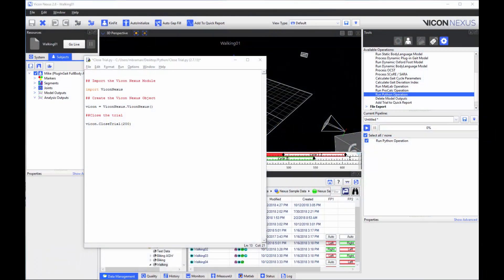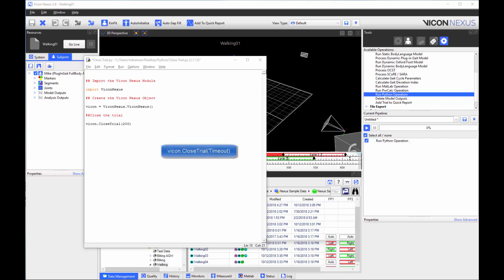You can now use the MATLAB and Python offline SDK to close the current trial without saving. To do this, you can use the command vicon.close trial. Timeout is in milliseconds and specifies the length of time during which the function tries to run.